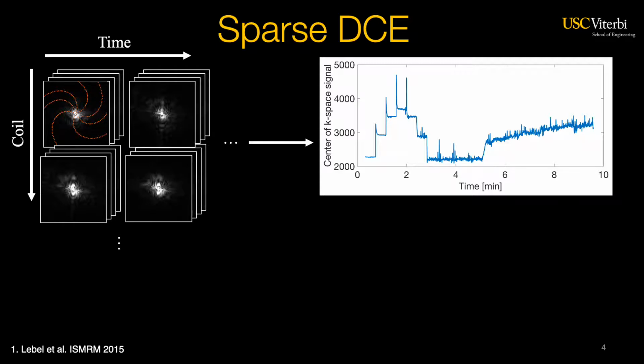During the first portion of this scan session, we successively ramp up the flip angle, starting at 1.5 degrees to 15 degrees in 7 logarithmically spaced steps. After about 5 minutes, you can see the enhancement due to contrast agent arrival in the field of view.